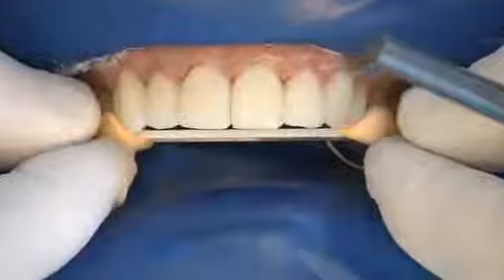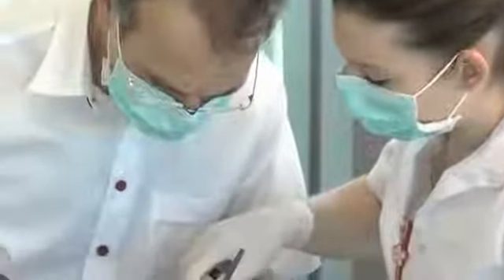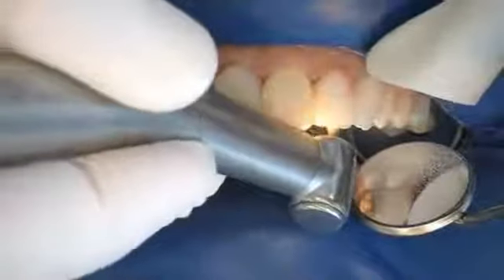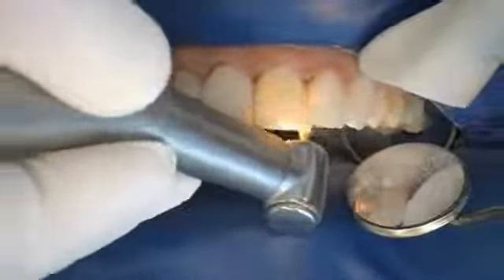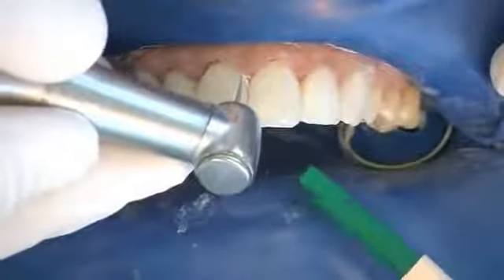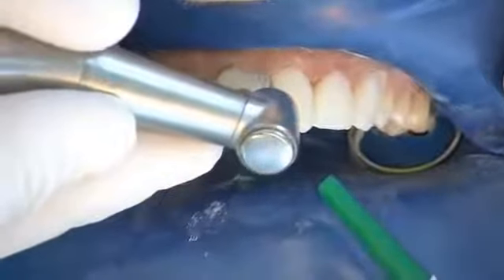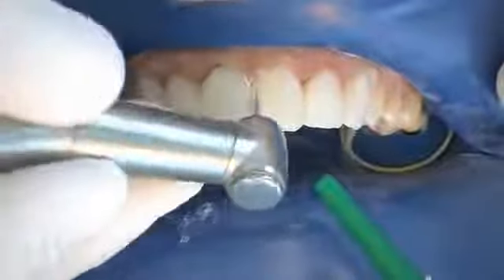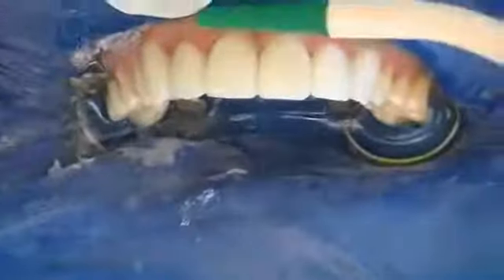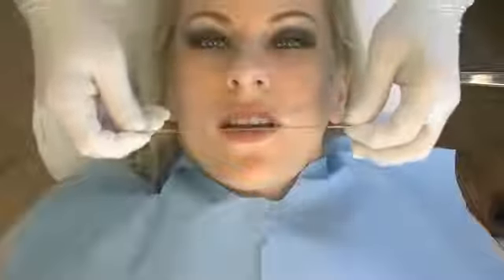Tooth axes and tooth lengths are checked before finishing. Large excesses are removed palatally with a pear-shaped coarse diamond burr and surface continuity is checked with a probe. Cervical areas, especially towards the interdental areas, are treated with a thin 40-micrometer flame-shaped diamond burr. Proximal-shape files are used to achieve optimum smoothing cervically; fine matching of axes and lengths begins after removal of the excess.